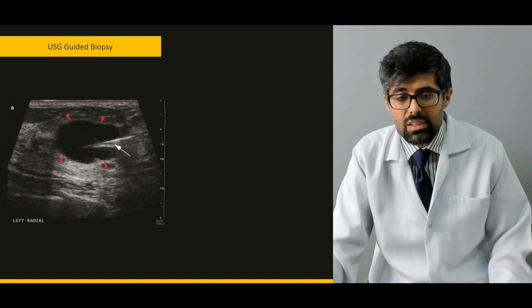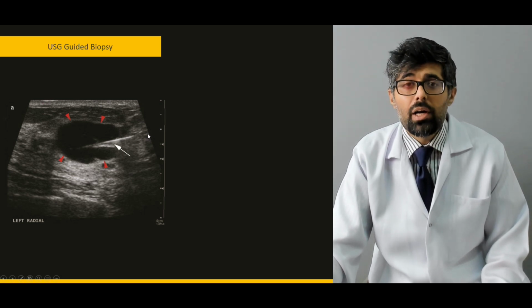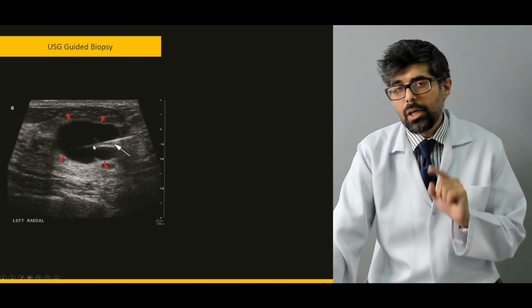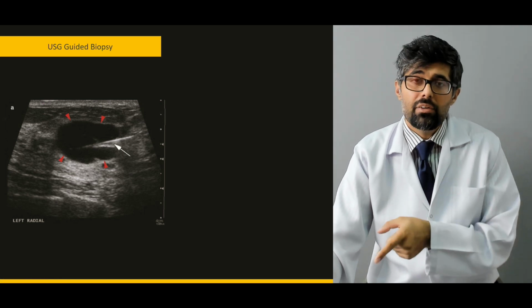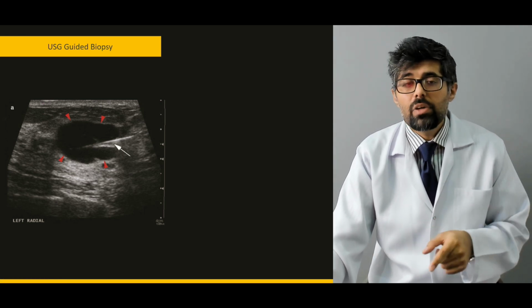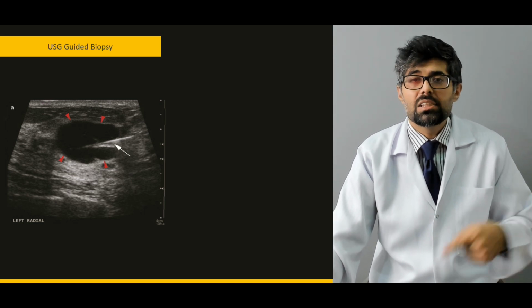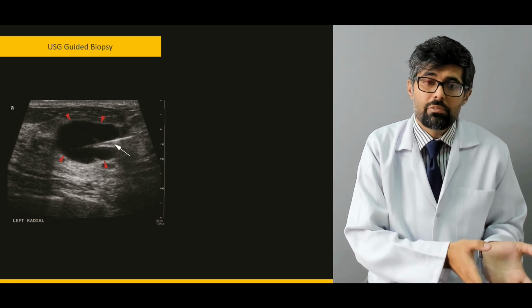Whatever it is, it can be aspirated via a needle, and for this needle to go right into the cyst and not puncture the other areas of the breast, we need guidance, and here guidance from only one axis is enough if the doctor is trained well enough.